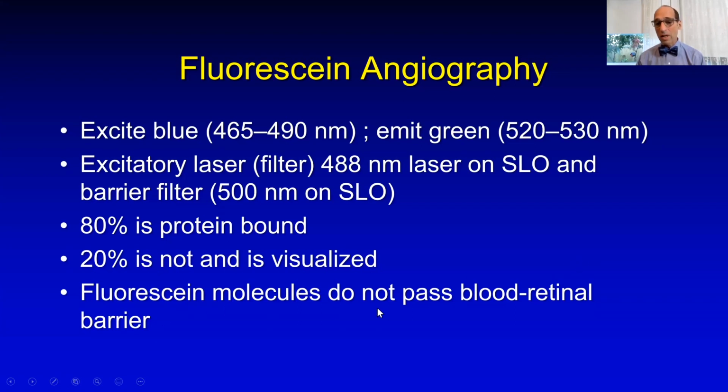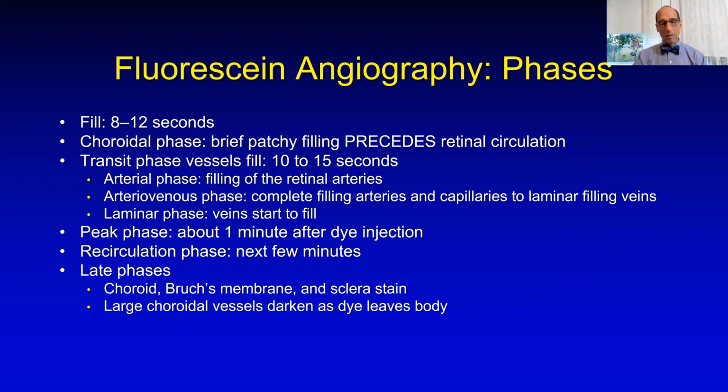And fluorescein should not pass through an intact blood retinal barrier. This is why we may not lose fluorescein angiography, because OCT angiography doesn't help you assess the blood retinal barrier. It's just a static image, even though they're very pretty images. Whereas fluorescein can show you things like leakage. So I'm not sure fluorescein is going to go away. It might.